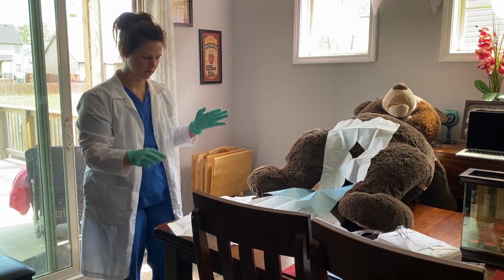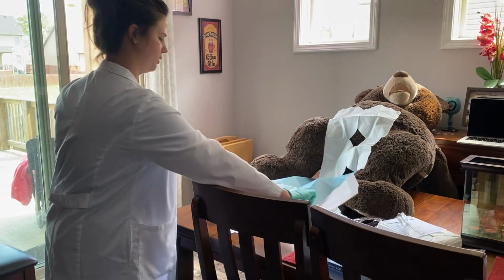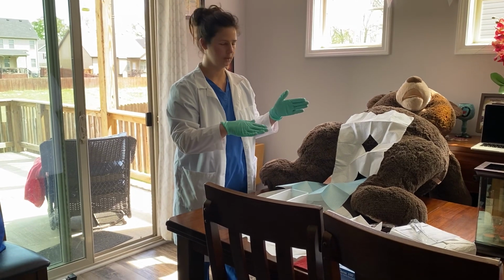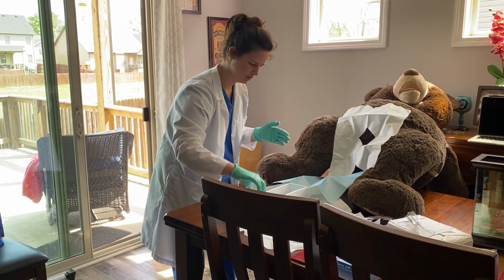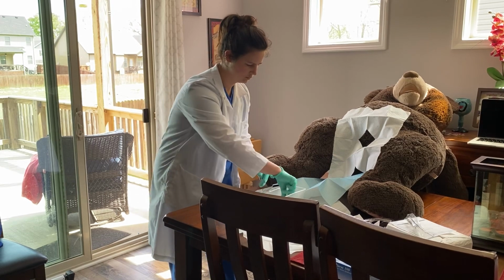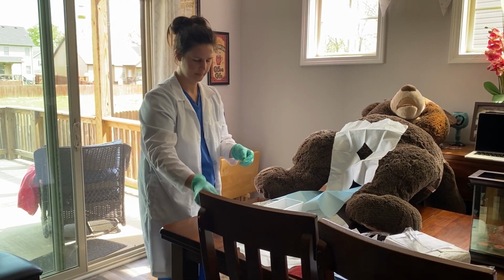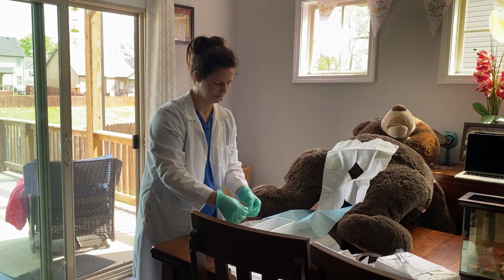So I'm going to put this sterile field in the gloves over here so that I can put my urine specimen on there when I'm done. And what we first want to do is clean the meatus. So we're going to grab the urine cup, lubricant. We've got the label for the cup here that you want to have set off to the side so that you can put at least 2 identifiers on that to send off to the lab.